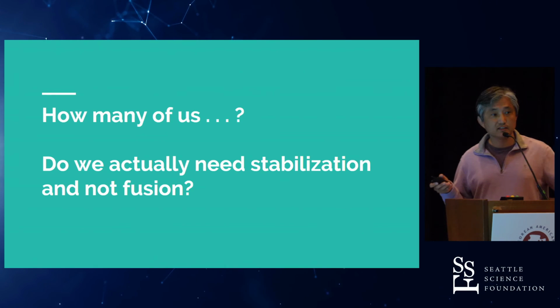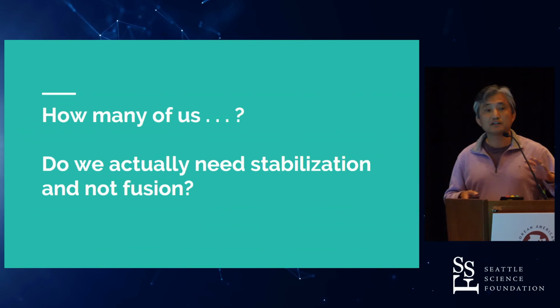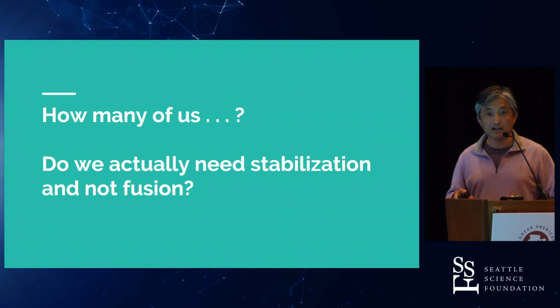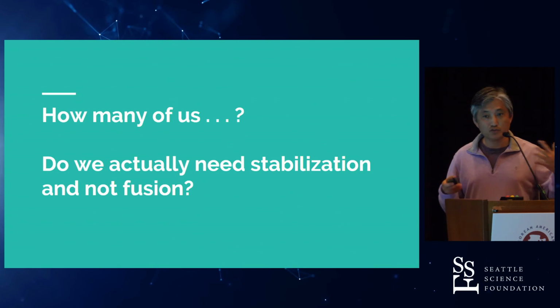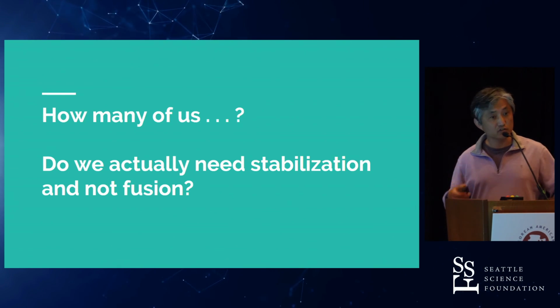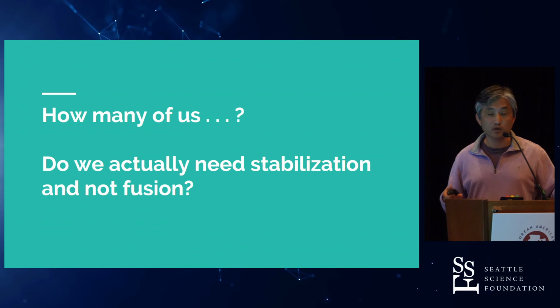Okay, so I want to end by saying to you, after this presentation, perhaps you should go back and think about whether you'll be using titanium cages or not. I don't know if you'll change your practice, but I also want to end by asking a question. I'm not quite sure it's the fusion rate that is going to make a difference. Maybe what we should be shooting for is not fusion, but stabilization, which may be fusion, but some of my patients are not fused and are still doing quite well.